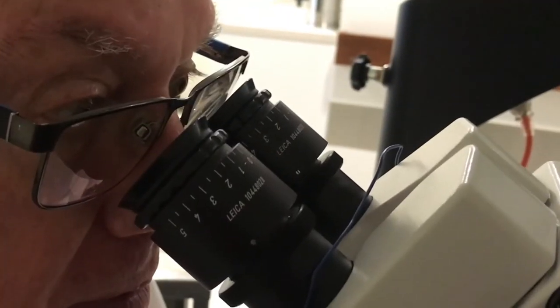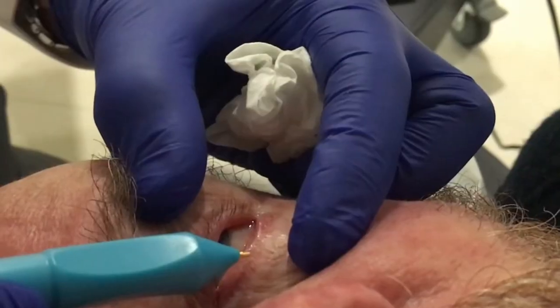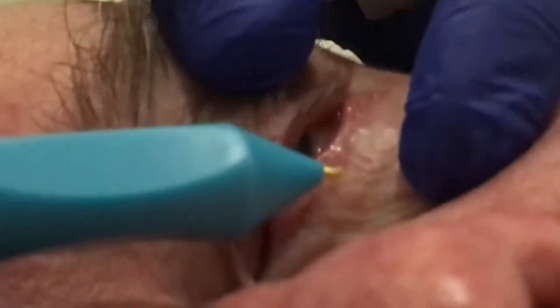With magnified viewing, gently insert the sterile needle into the follicle of the hair to be treated. The appearance of tissue bubbling at the surface will indicate that electrolysis has just begun.